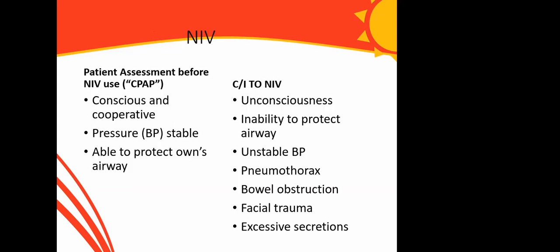No, like I said, you need to rule out contraindications. Some of the contraindications to non-invasive ventilation are unconsciousness, patients who have reduced consciousness and are not able to protect their airway, patients who have an unstable blood pressure, hypotensive, patients with pneumothorax, bowel obstruction, facial trauma, and excessive secretions. These are some of the common contraindications to non-invasive ventilation.